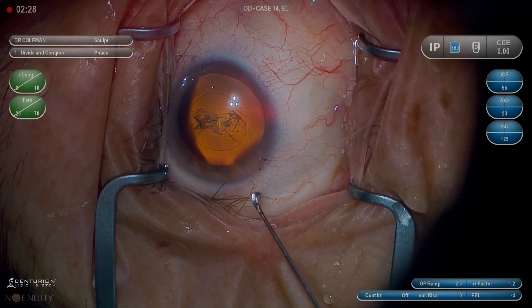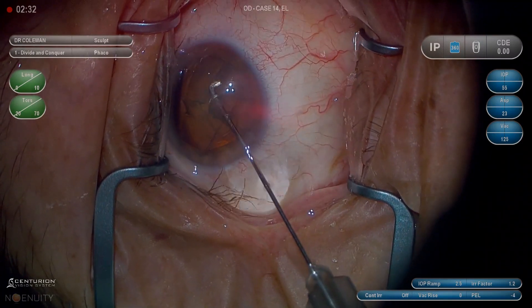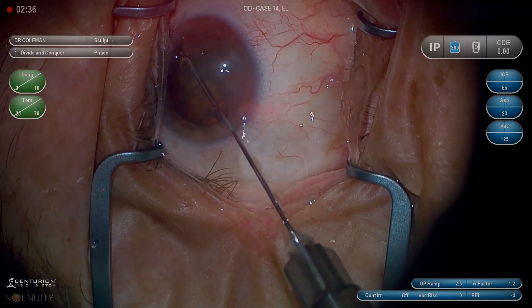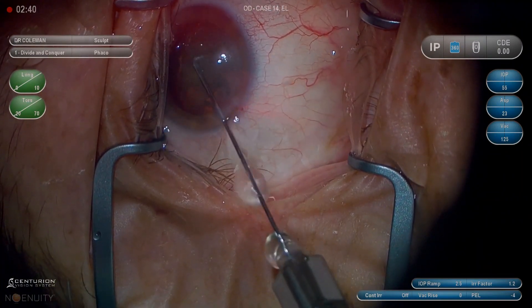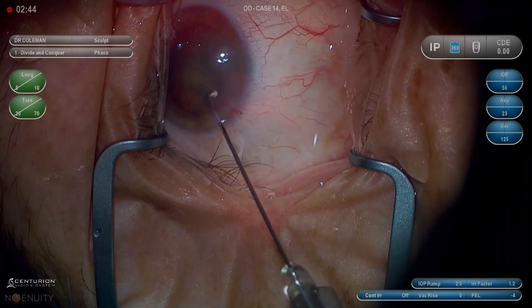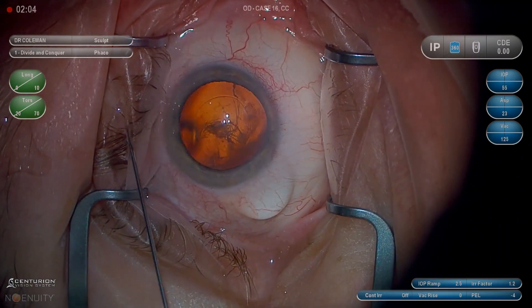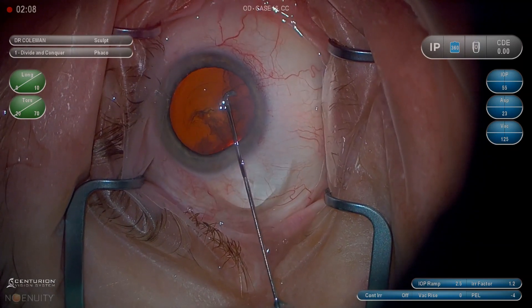If the wave is incomplete on one side, I'll rotate to the other side. Usually my wave has been complete. I usually go into the right first — right or left doesn't really matter, it just seems easier to the right to me. I'll get a complete fluid wave there, and then on the other side there's very little flow of BSS needed. I'm just trying to unzip the cortex from the areas of the capsulorhexis that the fluid wave didn't separate.